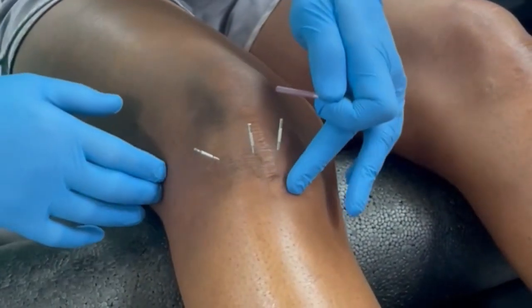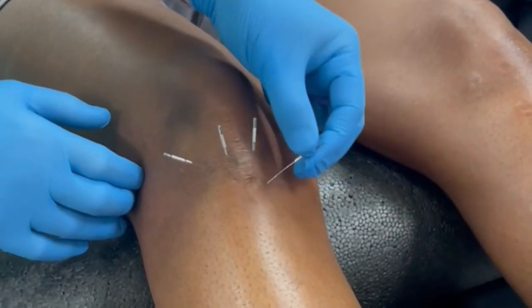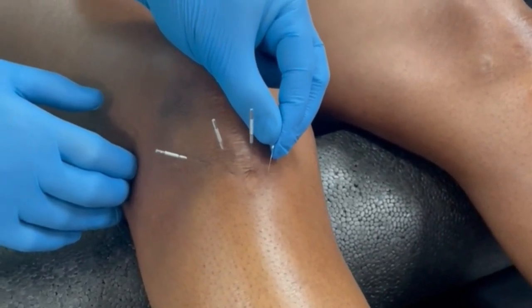Is this where you would do spinning too? Oh yeah, we're going to do that next. Will we spin for the tendon or just mostly for the scar? Normally I do spinning for scar, but we're going to do it for this tendon too. And there's bone — just going to isolate that.